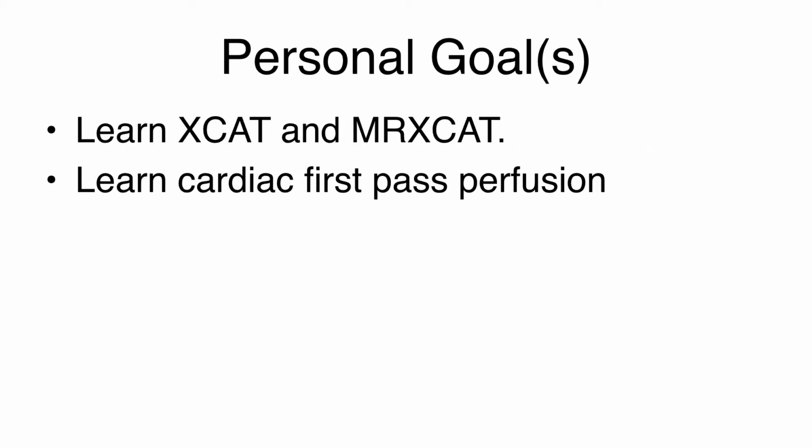The reason I chose this project was I wanted to learn digital simulation of tissue masks, as they provide a gold standard for evaluation. I also wanted to learn cardiac first pass perfusion because I believe it can help me for my research later on.